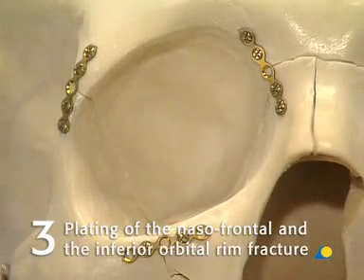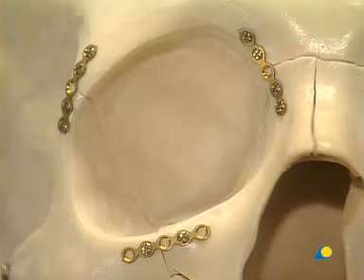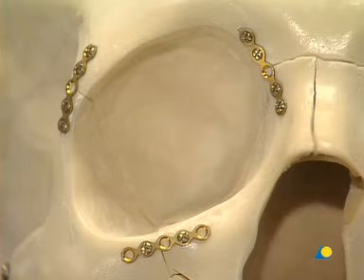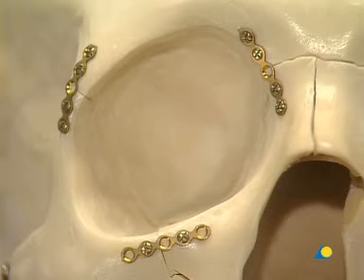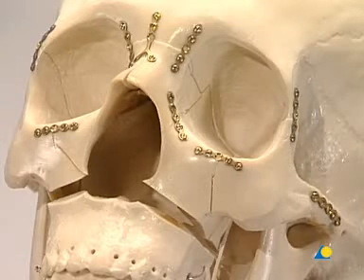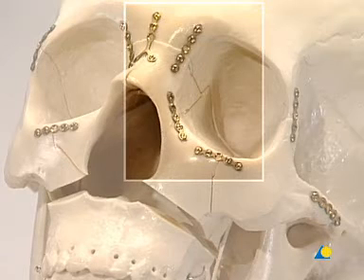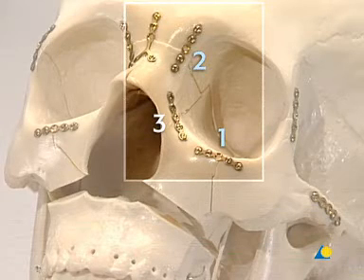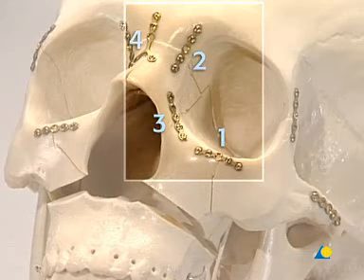Plating of the nasal frontal and inferior orbital rim fracture. Plating of the right orbital aperture is completed with reduction of the medial maxillary nasal segment. The nasal frontal and inferior orbital rim fracture plating is done with 1.3 plates, with a minimum of two screws inserted on each side of the fractures. Reconstruction of the left orbital rim starts with anatomical realignment; 1.3 plates are placed at the inferior orbital rim, the nasal frontal fracture, and the nasal maxillary process. An inverted 1.3 Y plate is used for further reduction and stability of the nasal skeleton.